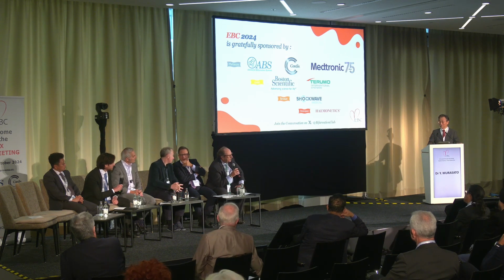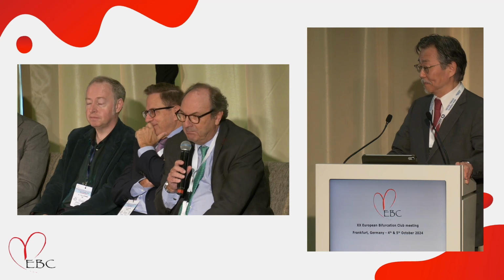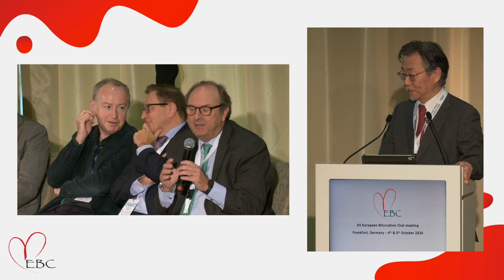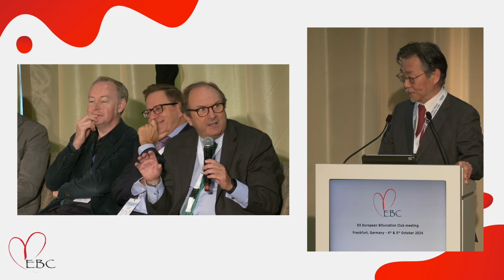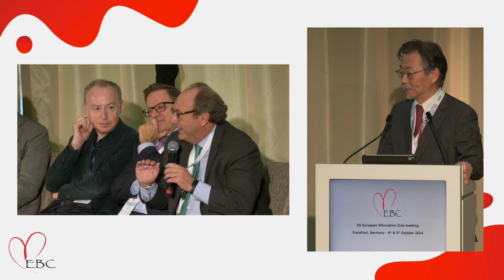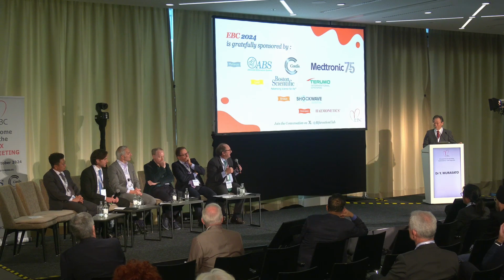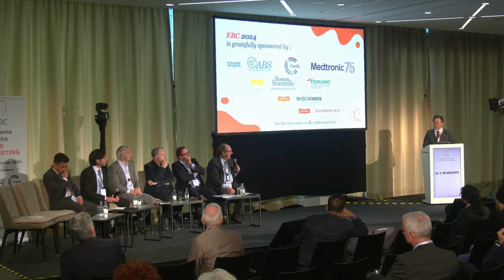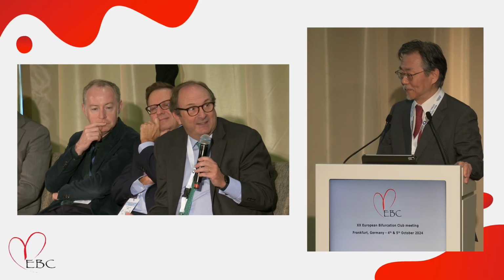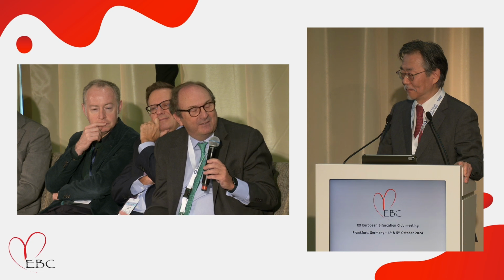Okay. Two years ago, we published a BIF-R consensus with Patrick. In the paper, you can see the ranking of severity of bifurcation lesions. 001 was the least severe bifurcation lesion. But in contrast, we have the worst result compared with other Medina classifications. I don't know if we have to rewrite the paper, or what is your opinion about this paradoxical finding.